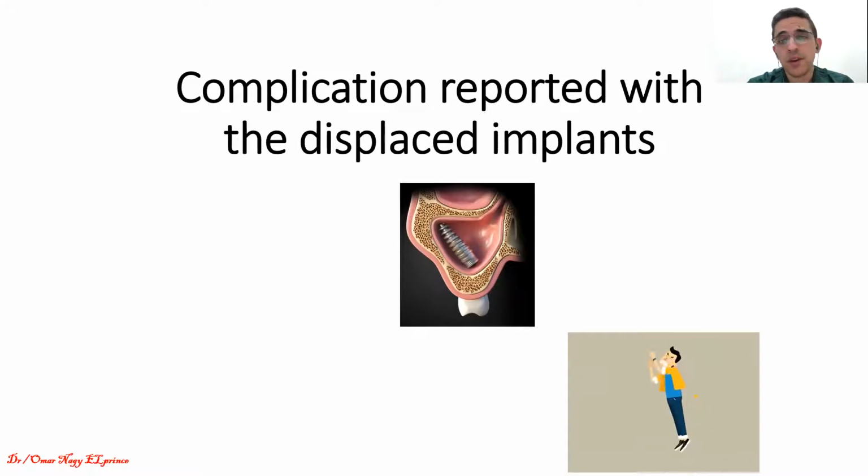So what are the complications? ايه الcomplications اللي احنا نتوقعها لو انا عندي implants displaced into the maxillary sinus؟ ودي حاجه من الحاجات المهمه واللي دايما بتتسال، يعني البيشنت ازاي عرف ان هو عنده implants displaced؟ يعني في ناس يقول لك مثلا في patient عنده implant displaced, he hasn't complained of anything. Does that really happen? هو بيحصل.